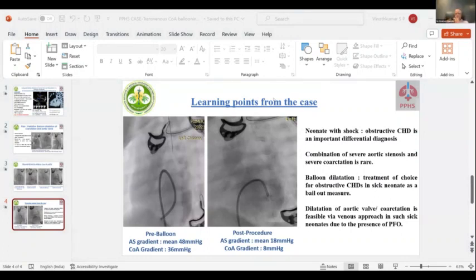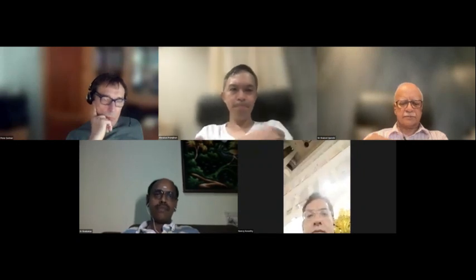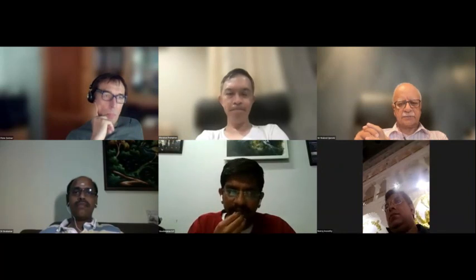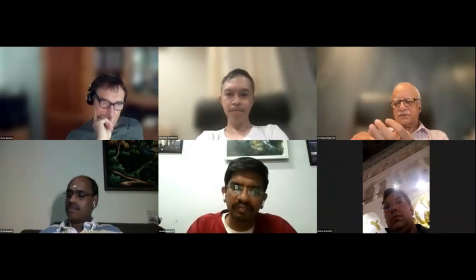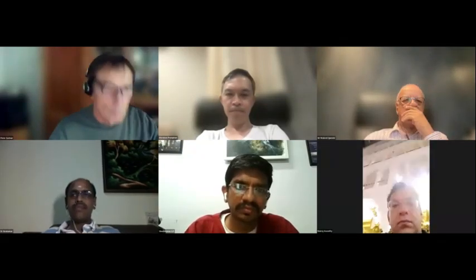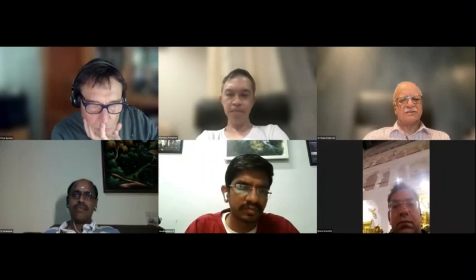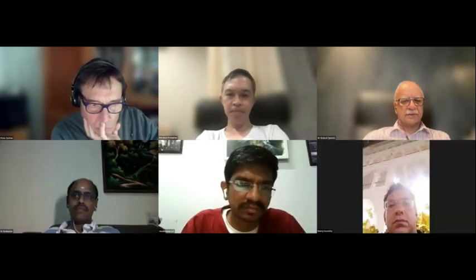Well, this is a really complex problem, and you've highlighted some of the issues. Working backwards, we would almost certainly have gone from a carotid approach for both the aortic valve and the coarctation if the patient was unsuitable for conventional methods. But if you're going from a femoral venous approach, again, weight is the key. You can use a balloon wedge catheter if you have one available nowadays, and see if you can float it through the mitral valve and up into the aorta. Otherwise, a lot of the time it's hit or miss whether you're going through the chordae or you're clear of them.